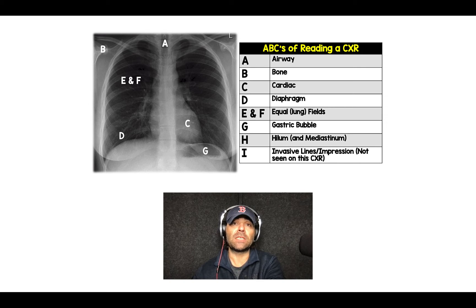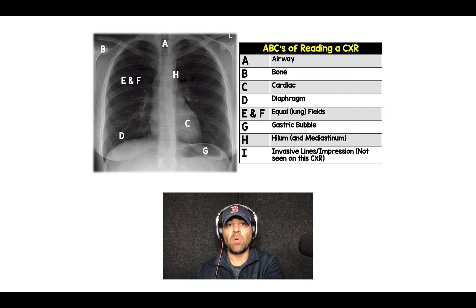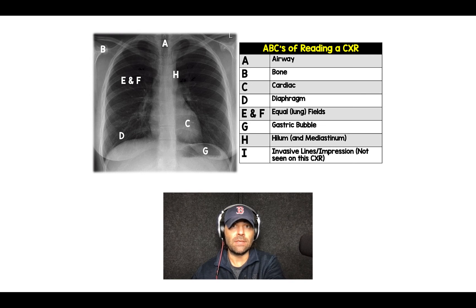G stands for gastric bubble, and this will be right underneath your left hemidiaphragm. H — which I have a little bit high in this chest x-ray — is going to be for your hilum and mediastinum. That means looking at the pulmonary arteries that are coming off and making sure that the mediastinum doesn't look widened.